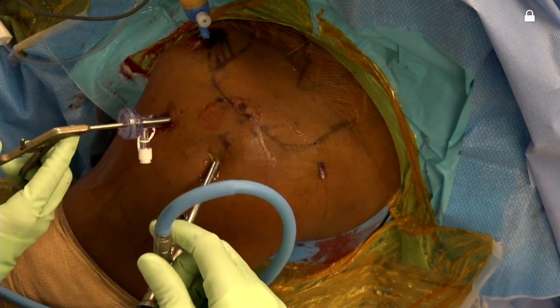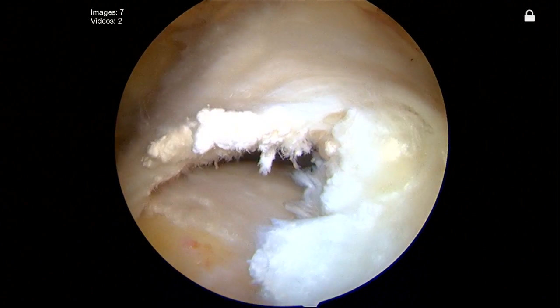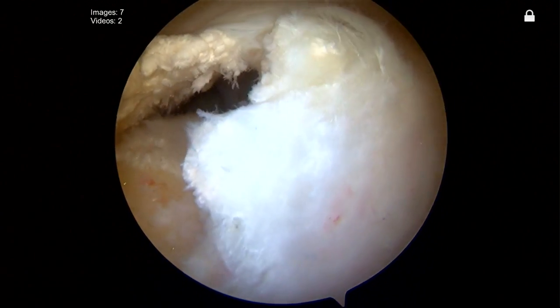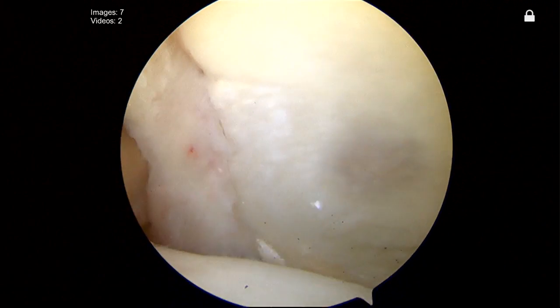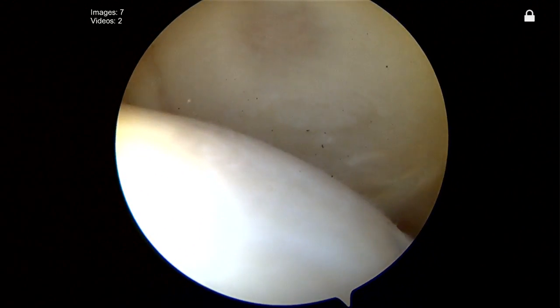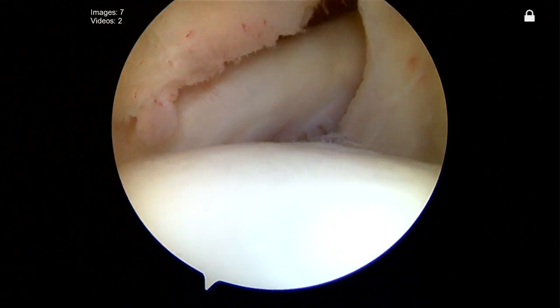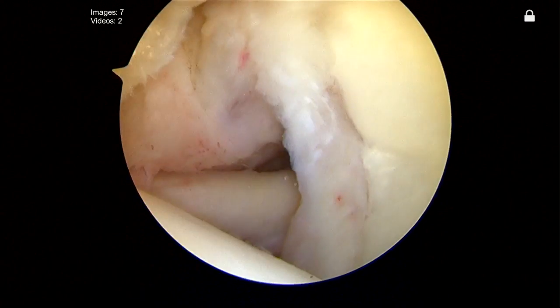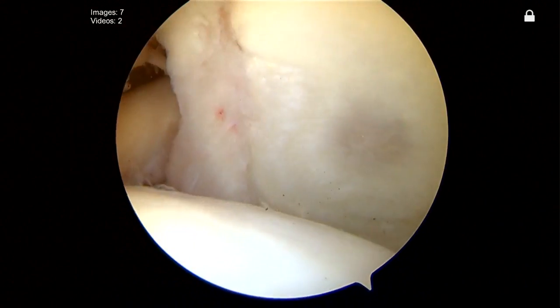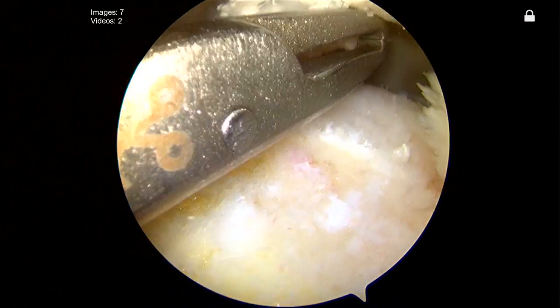We're in the subacromial space here. You can clearly see that she has a superior rotator cuff tear involving the supraspinatus with some involvement of the infraspinatus. You can see that the glenohumeral joint is very well maintained — articular cartilage is maintained on both the humeral and the glenoid side. Here you see the subscapularis, which actually turned out to be fairly normal in appearance. We've already released the biceps, did a light debridement of the stump as well as of the labrum itself. Now we're up on top preparing for our rotator cuff repair.